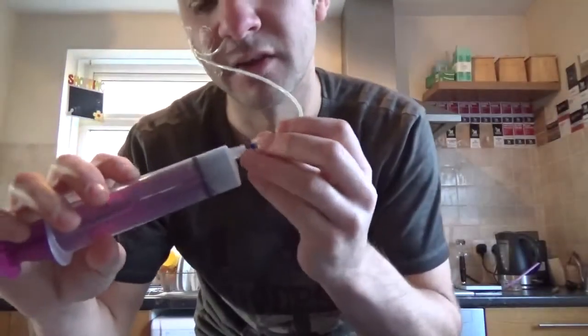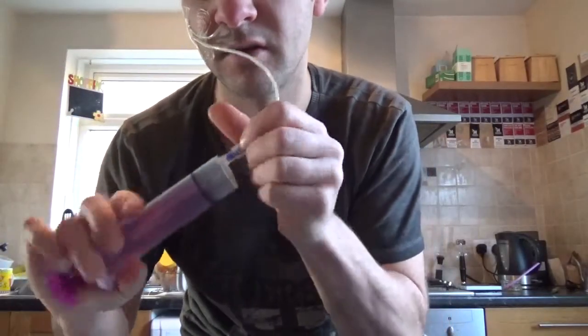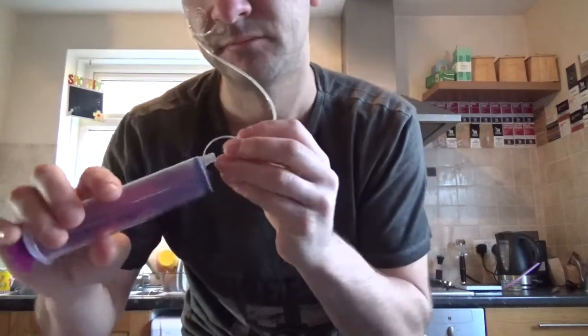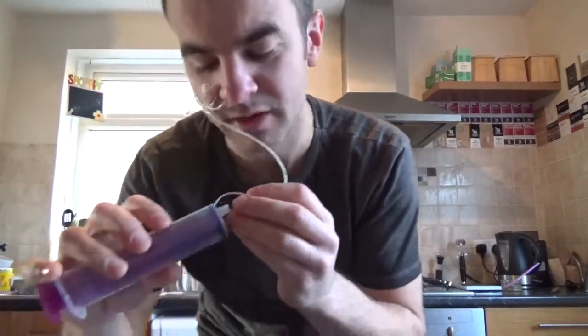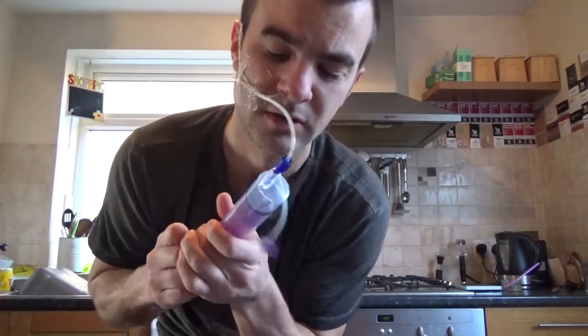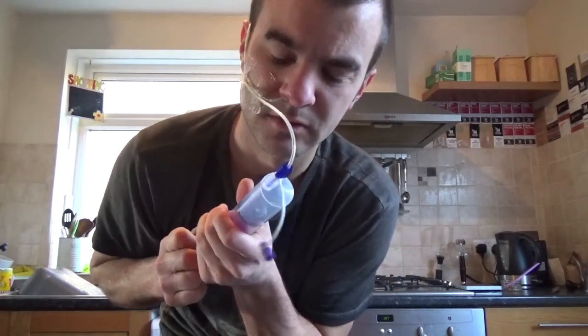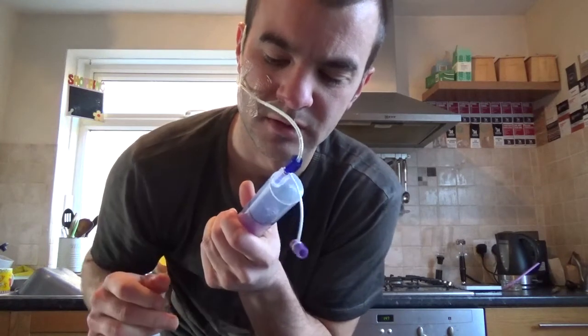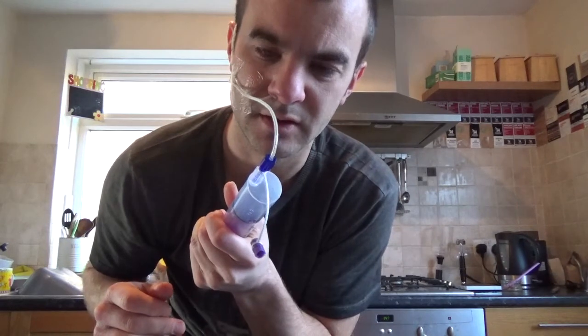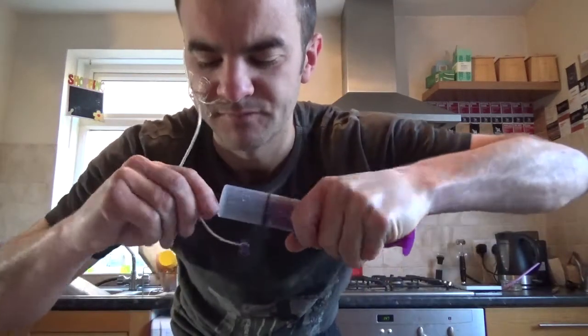Right, let's have another go. The marker is still at the same place, so I know the tube hasn't moved at my nose. Still nothing.